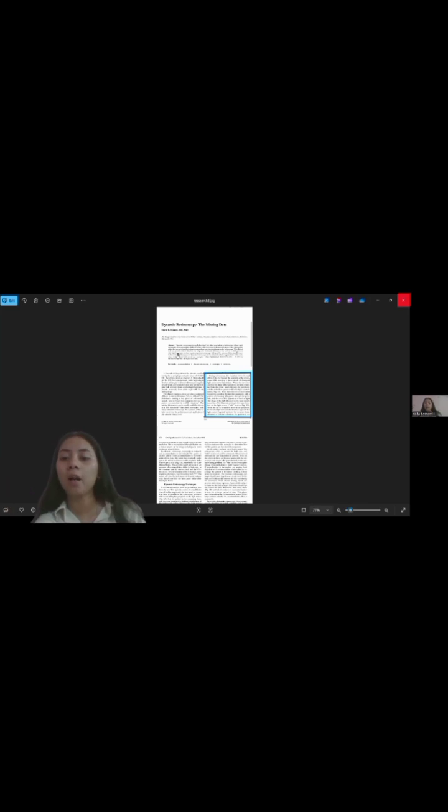Too little lag or a lead suggests over-accommodation, common in hyperactive focusing. These readings help detect conditions like accommodative insufficiency or spasm of the eye, which can cause headache, blurry vision, or eye strain while reading or doing any work.